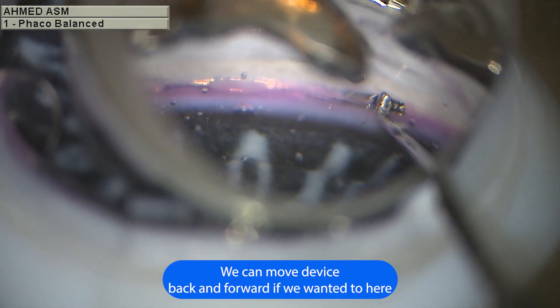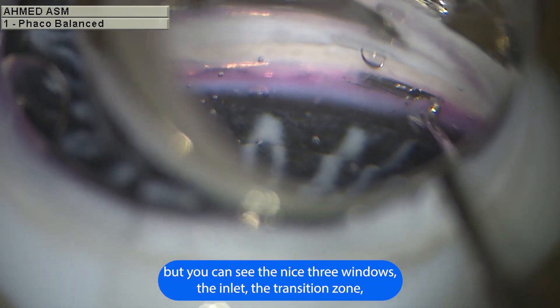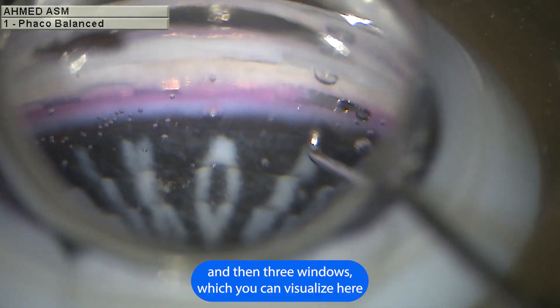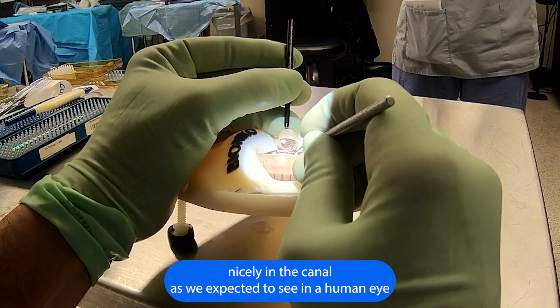We can move the device back and forth if needed. The anatomy allows us to do this, and you can see the nice three windows — the inlet, the transition zone, and then three windows as you can visualize here nicely in the canal, as we'd expect to see in the human eye.